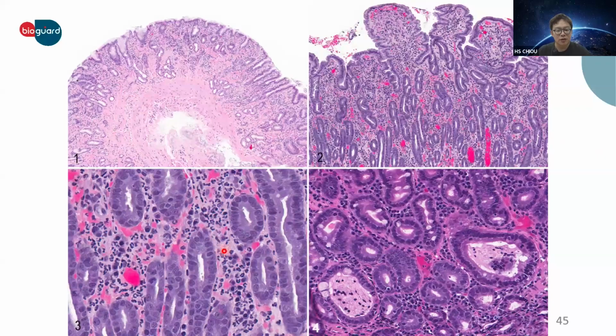And this figure is also duodenum. Within the lamina propria, there are markedly increased numbers of neutrophils. This suggests active inflammation, possibly ongoing epithelial injury. So here we're seeing the inflammatory component layered on top of the structural damage. This figure is the ileum. There's multifocal dilation of crypts. Crypt dilation indicates architectural distortion and regenerative stress. This often correlates with more chronic disease activity.